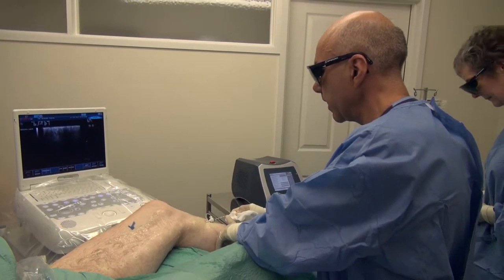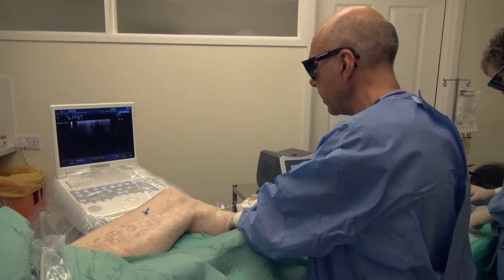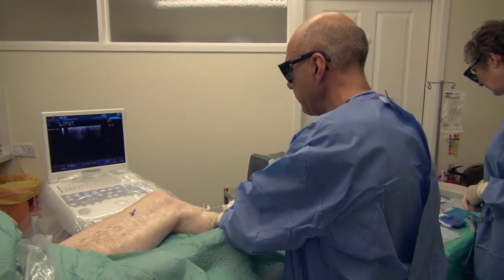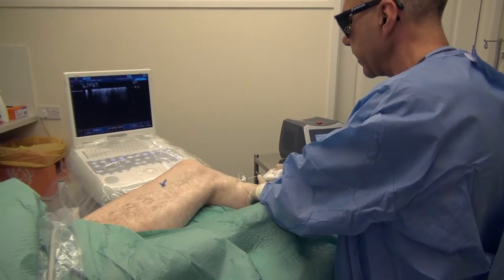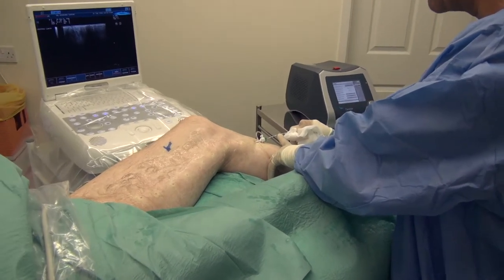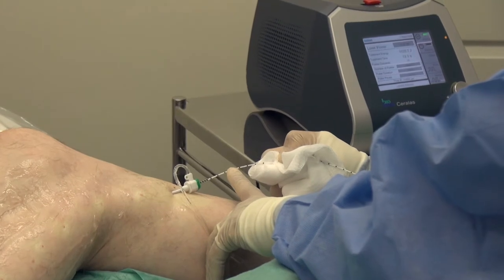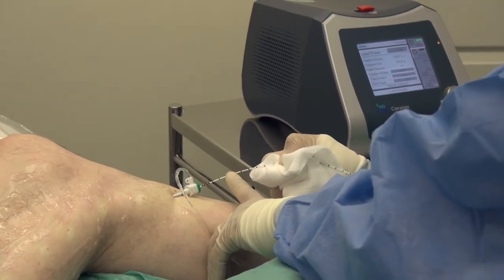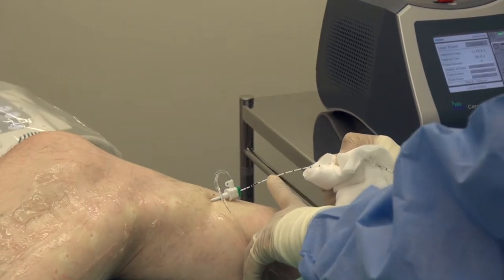I'm concentrating on the speed with which I'm withdrawing the catheter in relation to the metronome auditory signal I am hearing in the background. At the end of the procedure, Jane will have a record of the length of vein that we have treated, and there will also be a record of the total amount of energy delivered by the laser equipment.